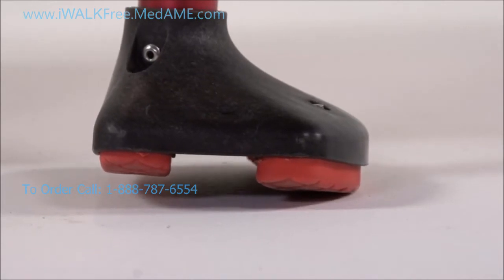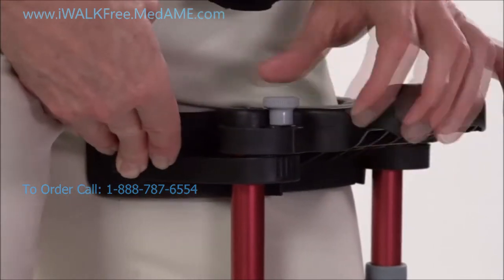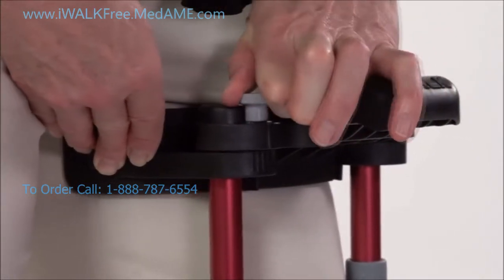You'll feel the inner tread touch the ground. When you're sure both treads are on the ground, push on the inner thigh support until it's firmly against your inner thigh. Now securely tighten the thumb screw to lock the support in place.